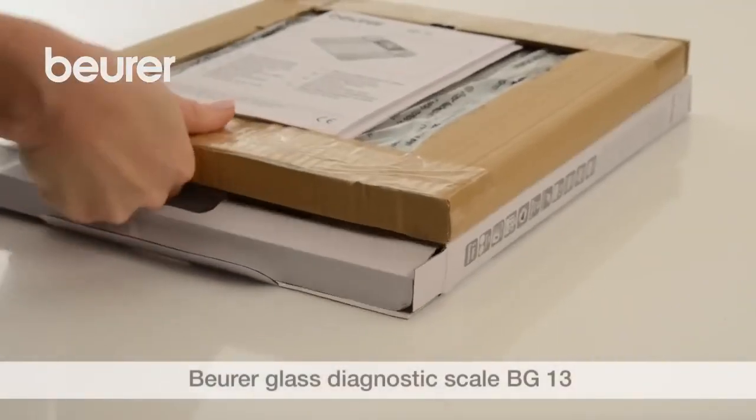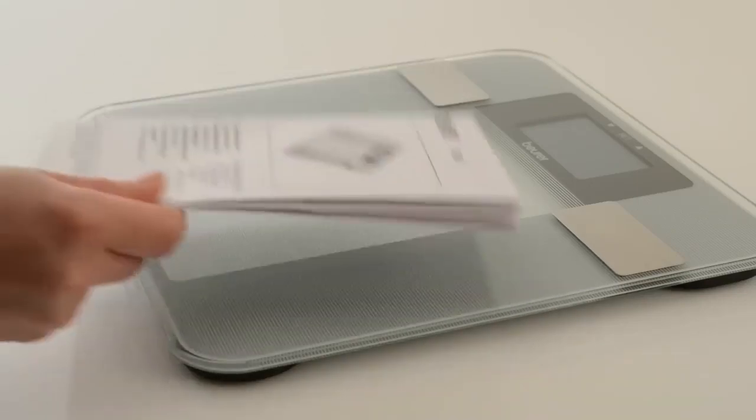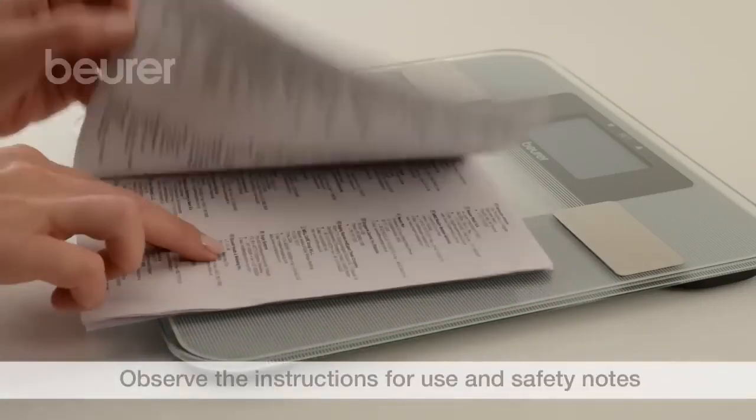Here are some tips for using your BG13 diagnostic scale from Beurer. Pay attention to the instructions for use and safety notes.